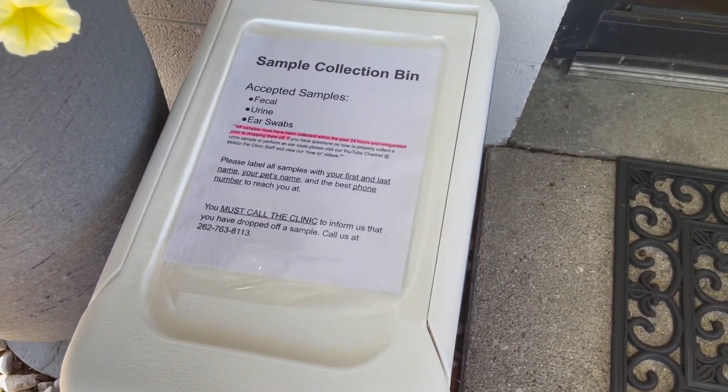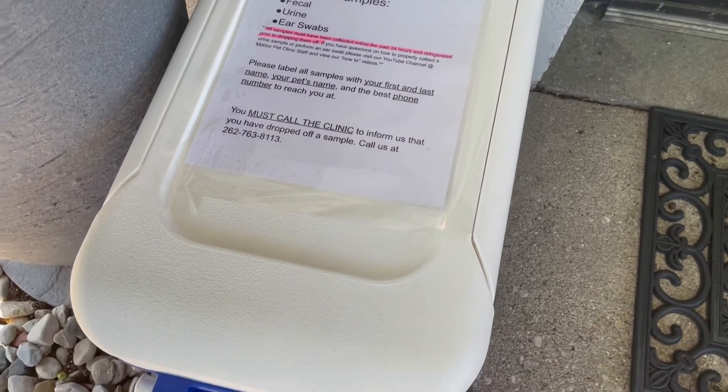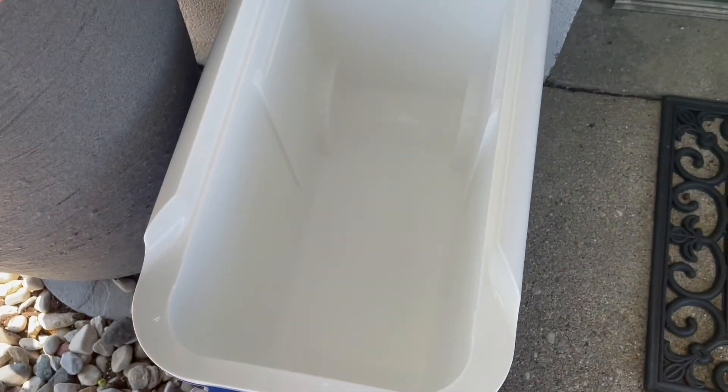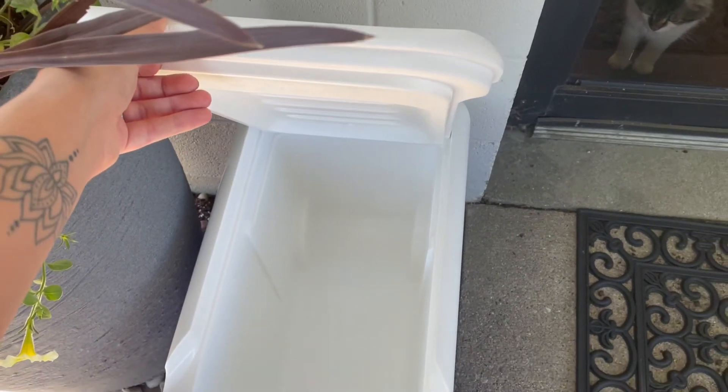Finally, you're going to drop your sample off at the sample collection bin outside the clinic's main entrance, and go ahead and give us a call to let us know that sample is in there. Make sure that you drop it off within 24 hours of collecting and that you keep it refrigerated between collecting the sample and dropping it at the clinic.